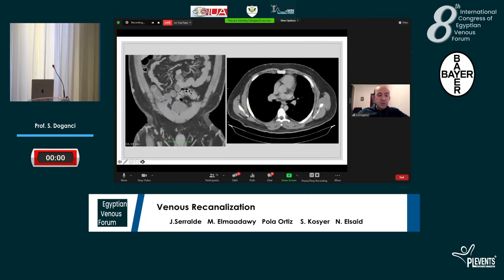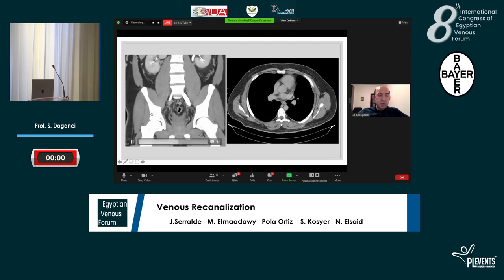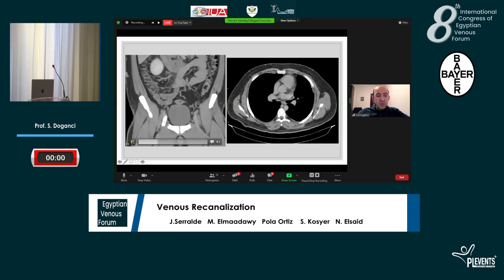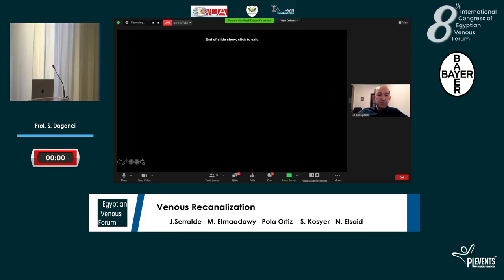And this is an example of a patient which I want to show you, something we shouldn't do. This is an ileocaval disease patient from another center. They stented this patient just for the iliacs and did nothing to the cava, so those stents got occluded, unfortunately. Especially as Dr. Lichtenberg mentioned a lot, this is not the correct way of doing this. We should learn it very well before doing anything, because to recanalize an occluded stent is really harder than doing it for the first time. And thank you for listening.